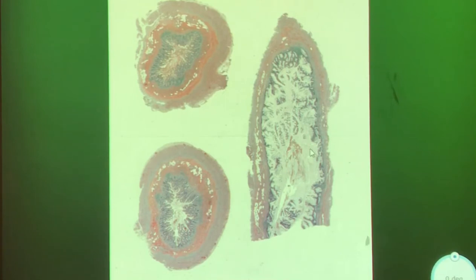So to me, well, okay, it's kind of unfair for me to say, to me, this looks like this, because I know what these are, since I put the slide decks together. But this is mucin pools. Okay, so the appendix is somewhat dilated, not terribly, but it is dilated with and filled with this mucin. Whereas maybe it's not as appreciable here and here. Like this looks more normal, even though there's maybe some blood going on. Anyway, we're looking at malignancy and pre-malignancy within the appendix, so this is probably what we want to look at.